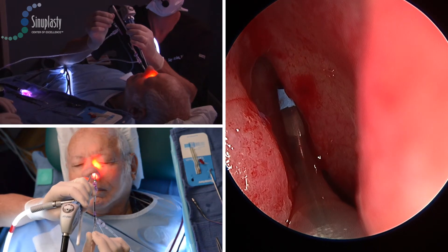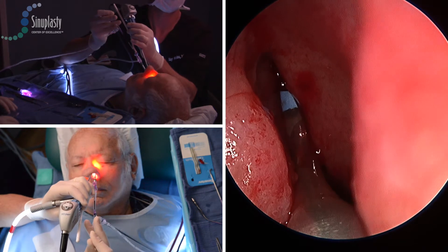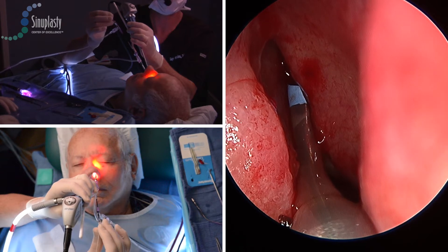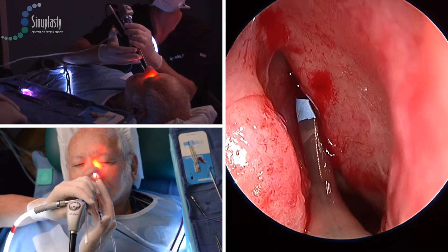Once the wire is able to be advanced into the frontal sinus, you'll see the illumination pattern on the forehead right about now. You can see that over the eye, and then after that's obtained, we will advance the balloon catheter.